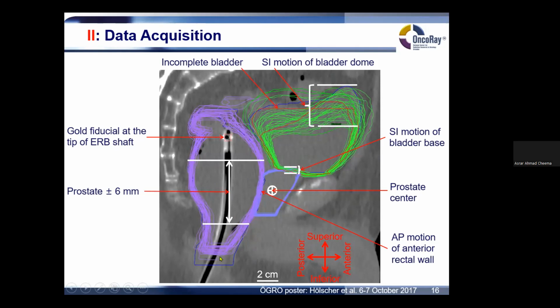This part of the region of rectum which is lying near the anus can also not influence the prostate. So this region is more relevant to assess the prostate motion driven by the rectal filling. And all motion and volume changes were calculated by subtracting the planning CT value from the control CTs.